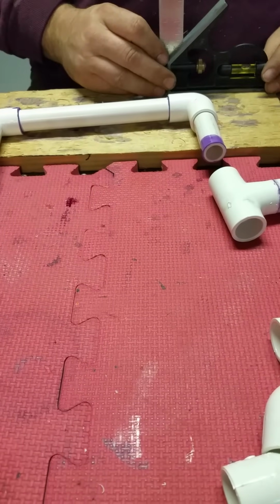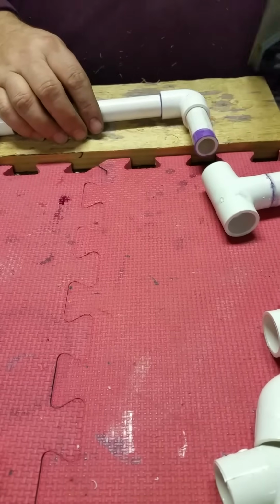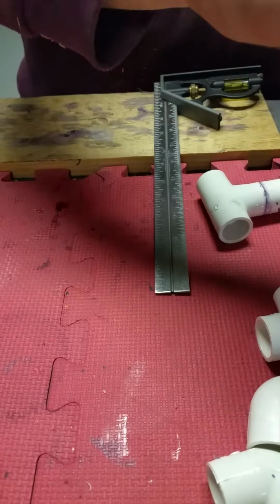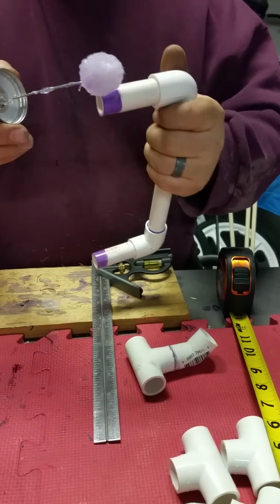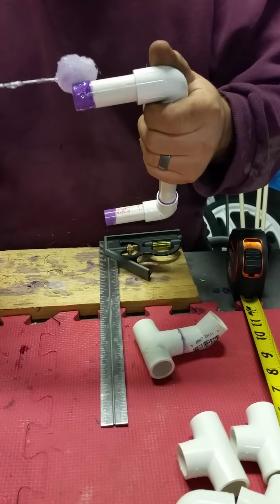Some people prefer to dry fit first to make sure that everything lines up. That might be a good way to do this as you start, just to make sure that you've got everything the right length and everything is symmetrical. But it also means you have to put the cart together twice.